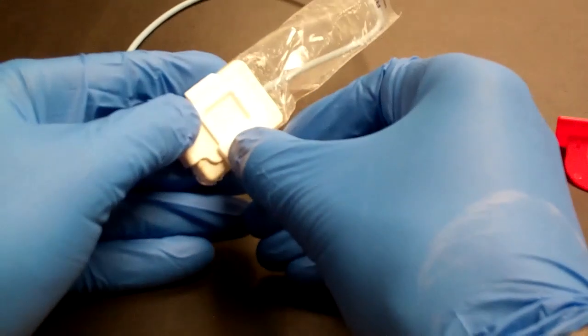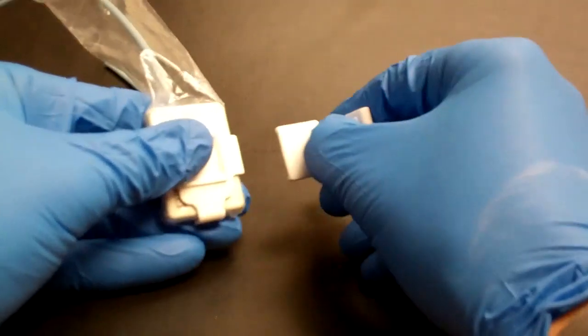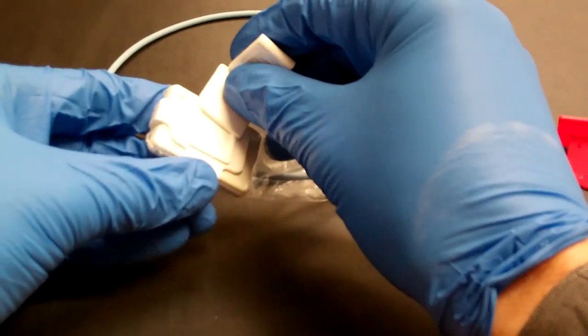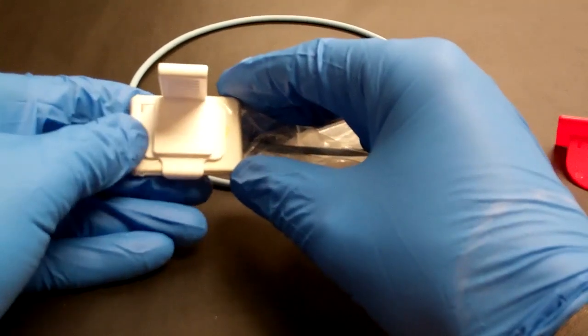For a posterior periapical, just attach it from the side. If you're changing quadrants, it's really quite easy. You just pull off that bite piece and attach it on the other side.